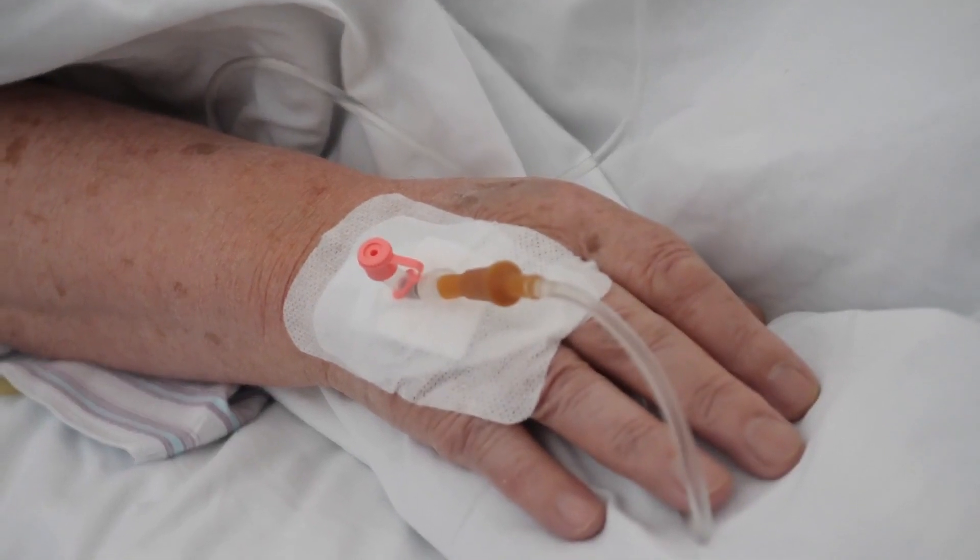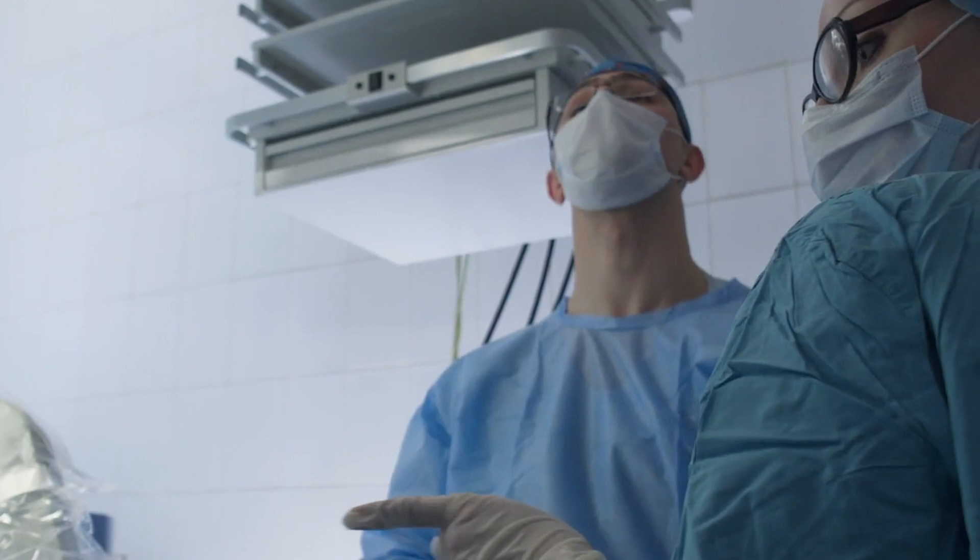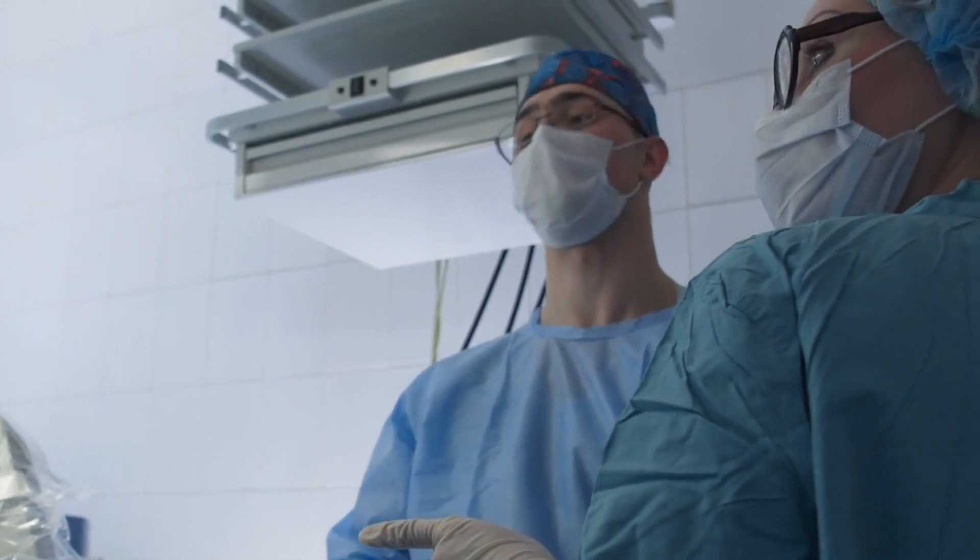A common question is how long will it stay in for? We try not to keep these sensors in for too long, but if a patient has had a severe brain injury they're likely to need one for as long as they're unconscious. Once they've woken up and we can gauge how they're doing using clinical examination, the whole thing can come out. If the bolt was put in to monitor pressure in someone who's awake, it usually stays in so that we can monitor the pressure in the brain for about 24 to 48 hours.